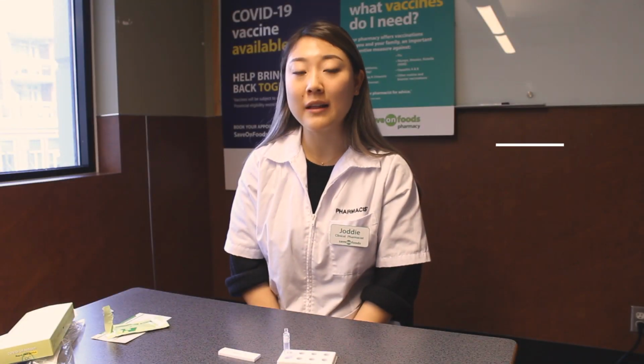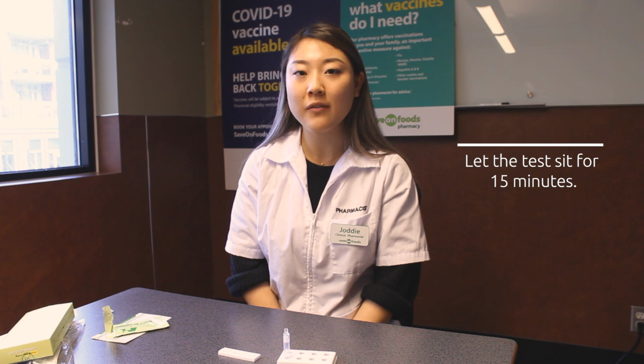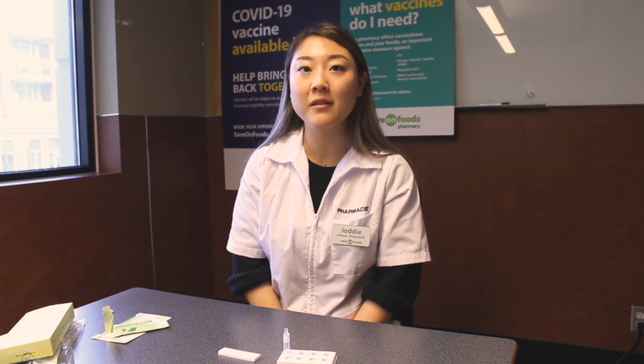So now we have to let the test sit and run for 15 minutes. During this period, it's very important to not touch the test device or it might give you inaccurate results.